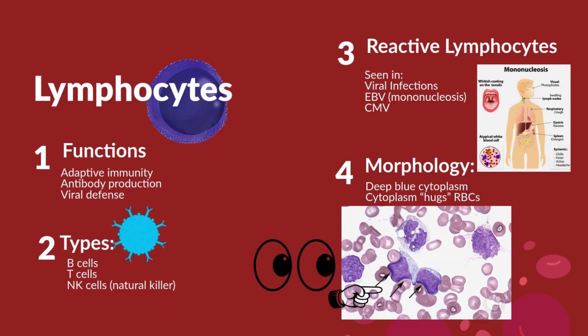One question on the MLS will want you to identify a lymphocyte. When you do that, you have to look at the chromatin, the amount of cytoplasm, the nucleus size, and the overall size. It's the small to medium. We just said it's small and medium. Do not identify using one feature. You've got to have three. You can find three here.